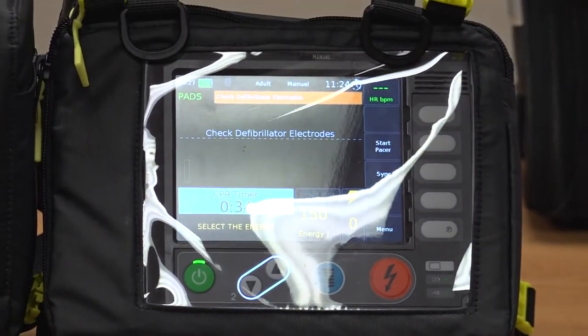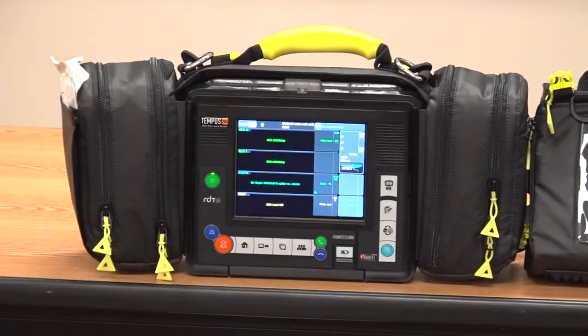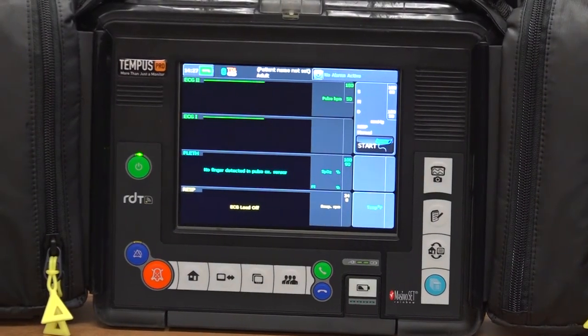Now that the monitor has booted up, the monitor is capable of taking blood pressure, SpO2, and tidal CO2, as well as doing a 3-lead and 12-lead.